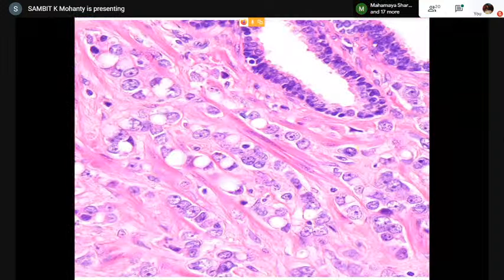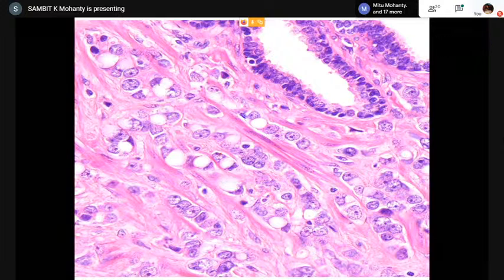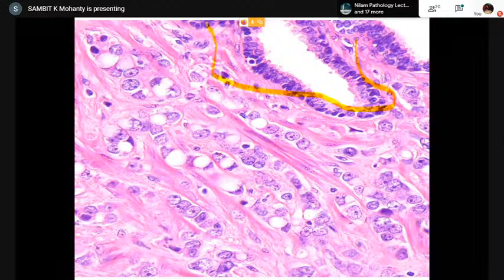How about this one? This is normal and abnormal. Okay. Is this structure normal or abnormal, on the top? This is a normal gland. And what happened is, is there a cancer? If there is a cancer, what kind of cancer is it? It's a signet ring, 5.